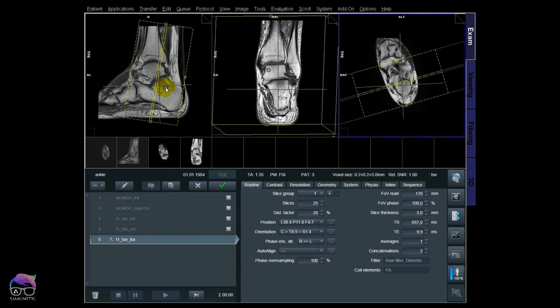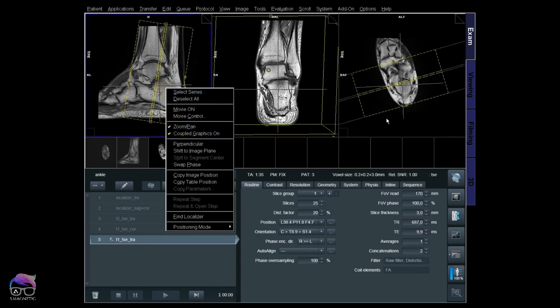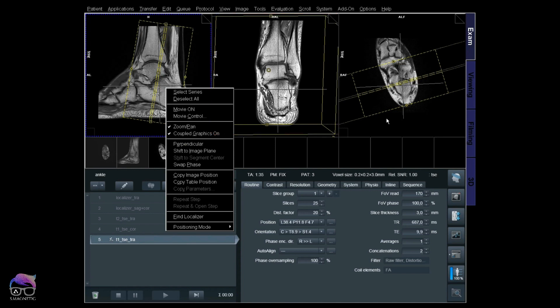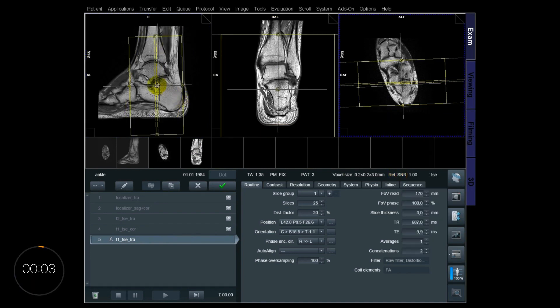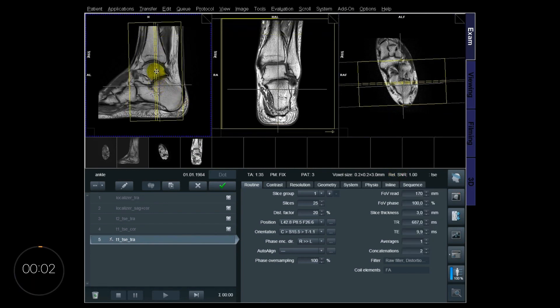Of course, if the anatomy is not correct after doing perpendicular, I do a little bit of angulation — I always go for anatomy. So for the coronal now: we leave the coronal alone, then only activate the sagittal and transversal. Take a closer look — there you go, there's your coronal!